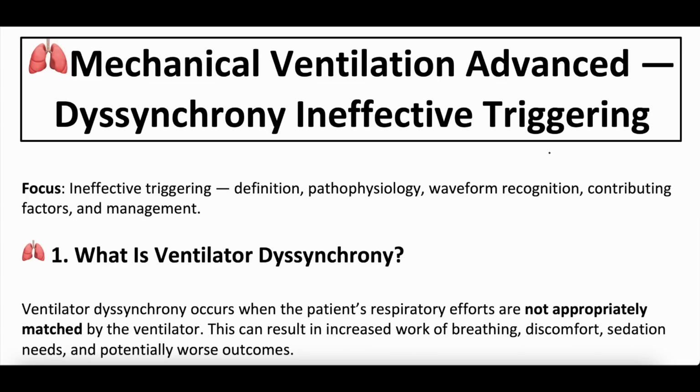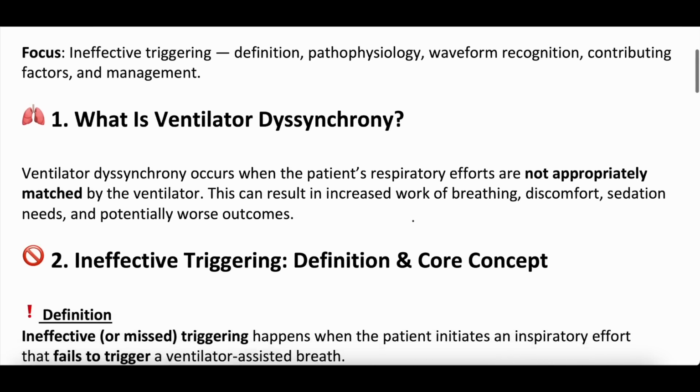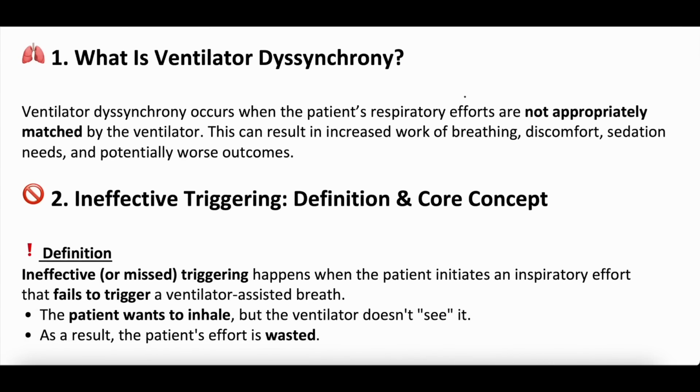Let's dive in. Mechanical ventilation advanced, desynchrony, ineffective triggering. So what is ventilator desynchrony? Probably a good first thing just to make sure we're all starting on the same page. Ventilator desynchrony occurs when the patient's respiratory efforts are not appropriately matched by the ventilator.